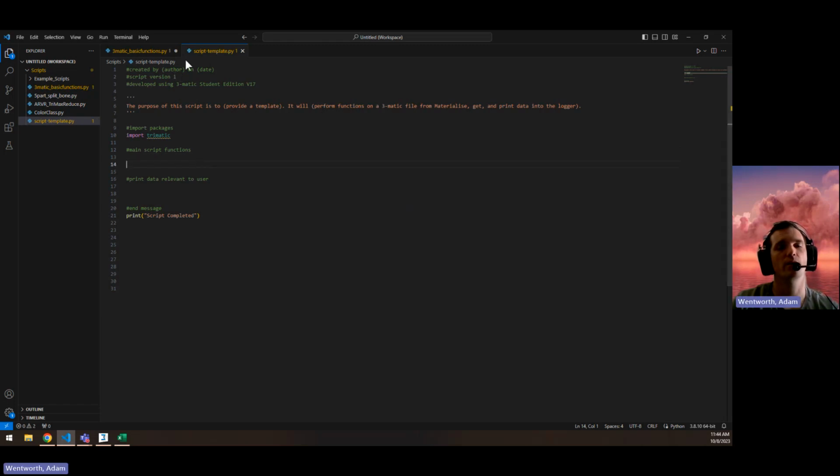Here I'm showing you a script template that could be used essentially as a way to outline your script from beginning to end. Some important features are putting your information on the top as far as the name and date, what version of the script it's on, as far as keeping track of any changes or change log that you might do between versions, as well as the version that you've developed it for or that it's been validated with. As you create scripts that create medical devices or things like that, you may want to ensure that other people would run the script only in the versions that it's been intended for or validated with. So it's maybe important to put that in there as well.